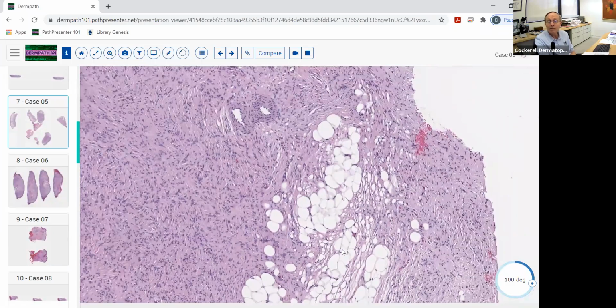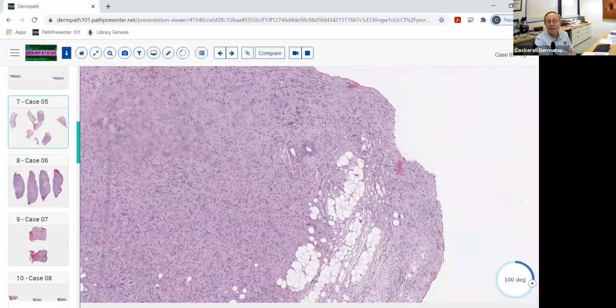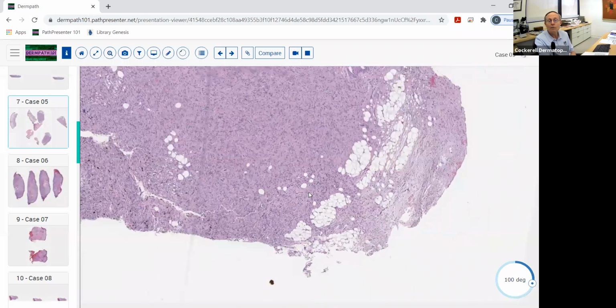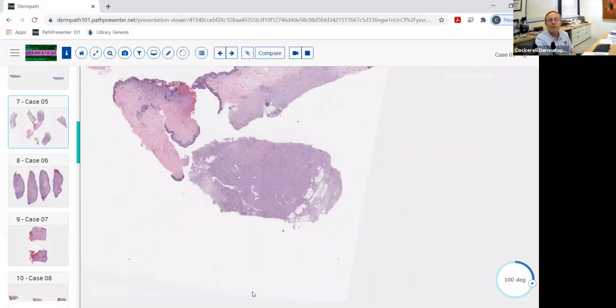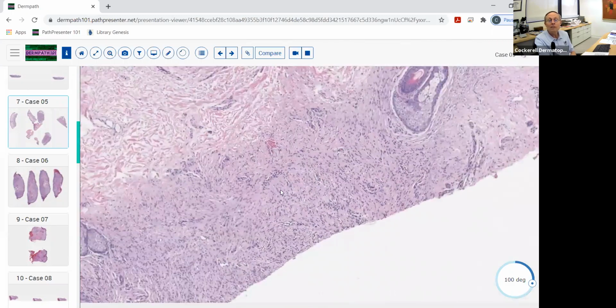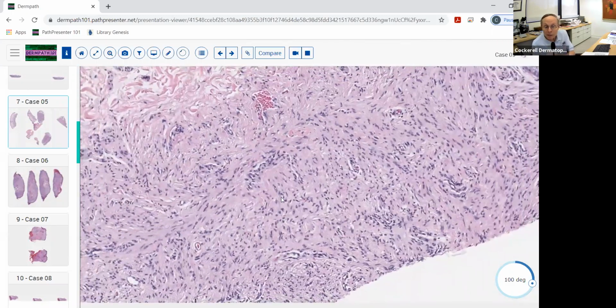And here you see the honeycomb involvement of the subcutaneous fat again. If you stain these, strongly positive once again for CD34, and you stain the melanocytes, they'll stain positively with SOX10 or with S100 proteins. So basically, this is just kind of a combination of DFSP plus a melanocytic element to it. Just kind of remember that one.